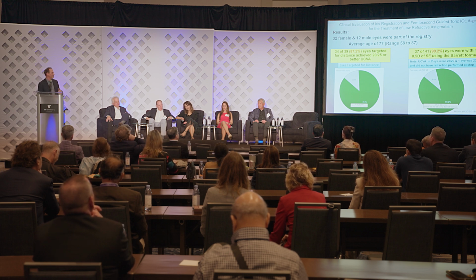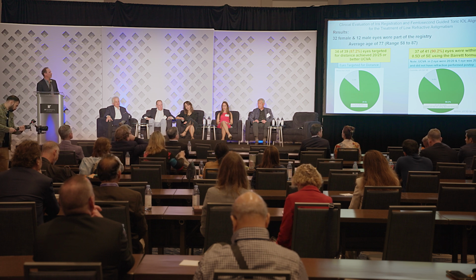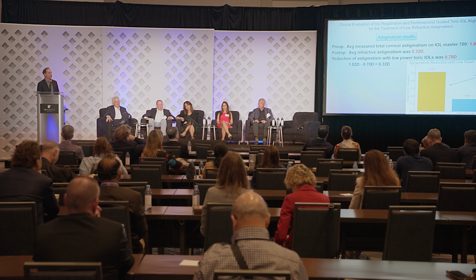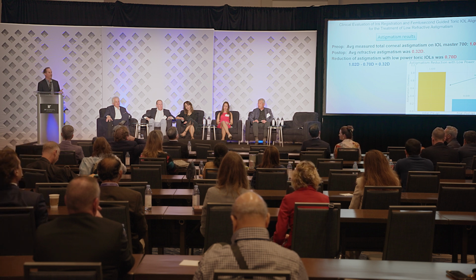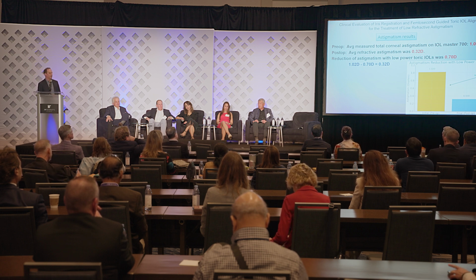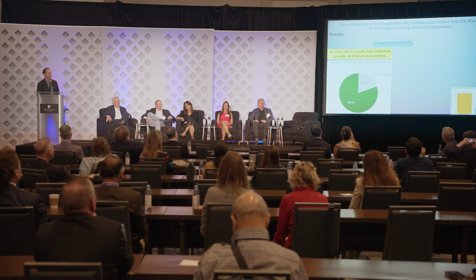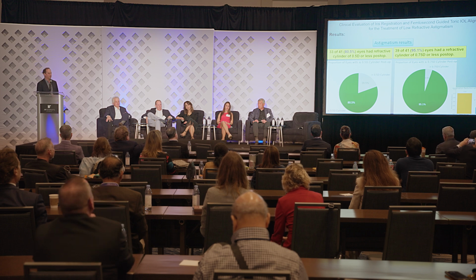And you can see that we had 87% of our patients that were targeted for distance achieved 20/25 or better uncorrected vision. We had 37 of 41 eyes that were within 0.5 diopters of spherical equivalent. For our astigmatism results, we started off with an average total corneal astigmatism using the Master 700 of about 1 diopter. At the end, after the toric lenses, they ended up with an average of about 0.32. So we had a reduction of about 0.7 diopters on average. And we ended up with 33 of 41 having a refractive cylinder of 0.5 or less post-op. And then we had 95% that were 0.75 diopters or less post-op.